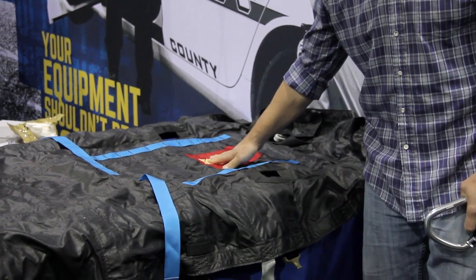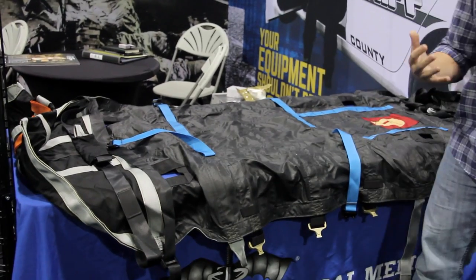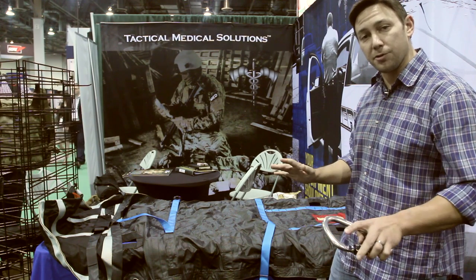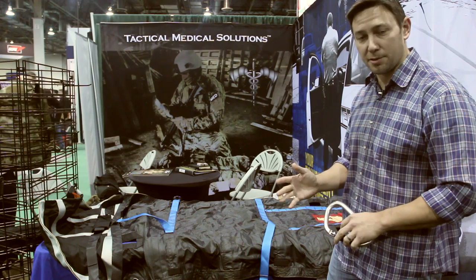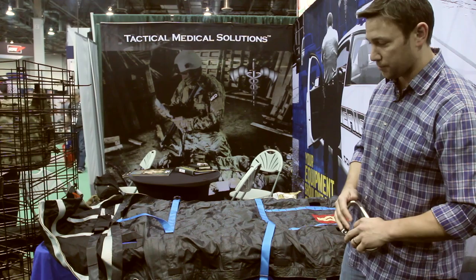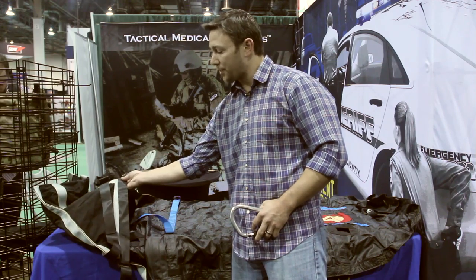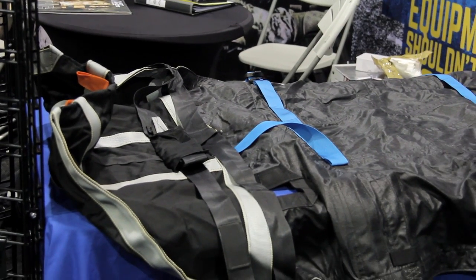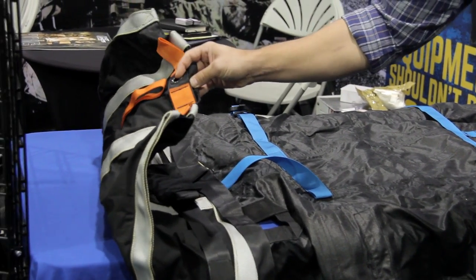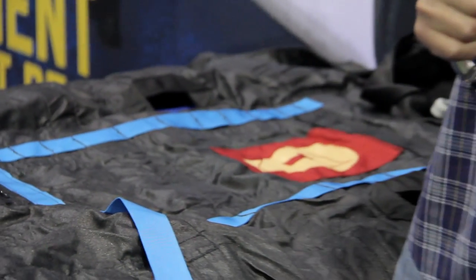You have an easily identifiable head marker. There are openings to accommodate the feet of a Talon litter if that's your litter of choice, however this system accommodates any litter — a Foxtrot litter, mat block litter, or no litter at all. The casualty's feet go in this bag here for positive retention so in a vertical hoist situation there's no chance for them to slip out. There are orange taglines at the feet and grommets and drain holes for maritime situations where you'll need flotation.